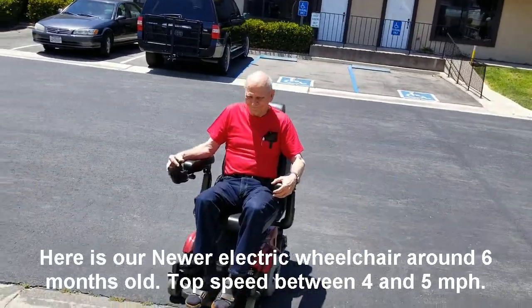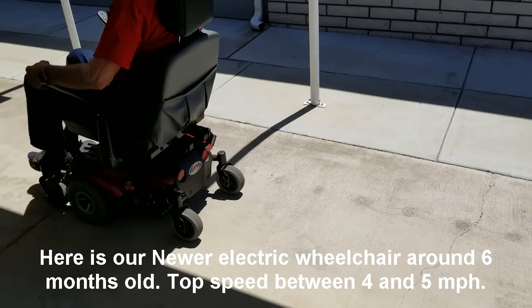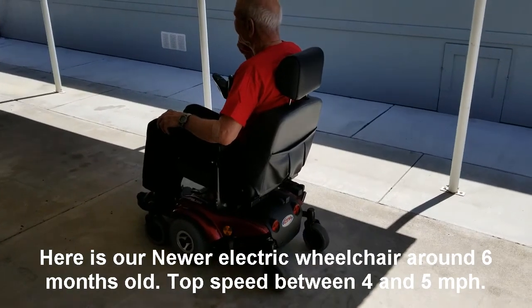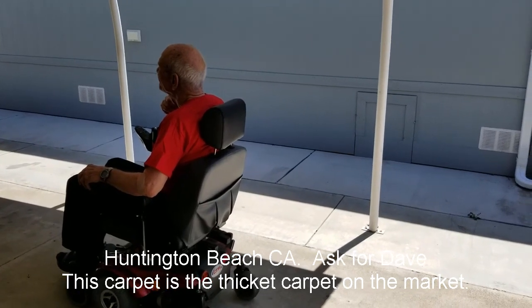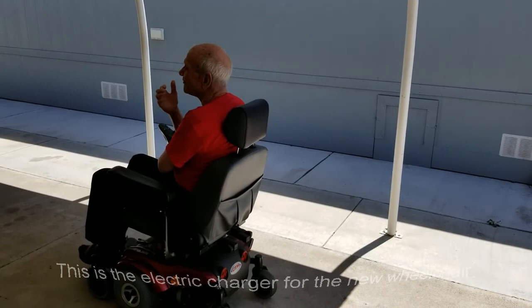Okay, well, that's our wheelchair — this is one of two. This is our brand new one. The other one was our used one — it's about 10 years old, while this is less than six months old. Thanks for viewing. Again, my name is David, and my number is 310-351-2961. Thanks for listening.